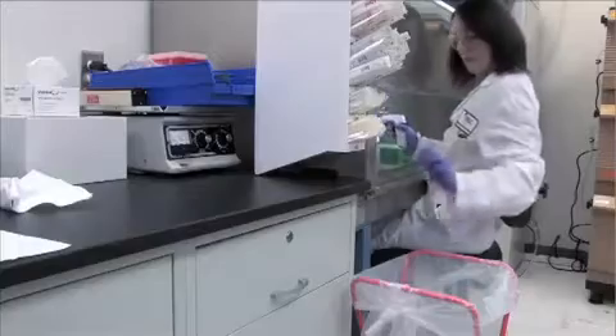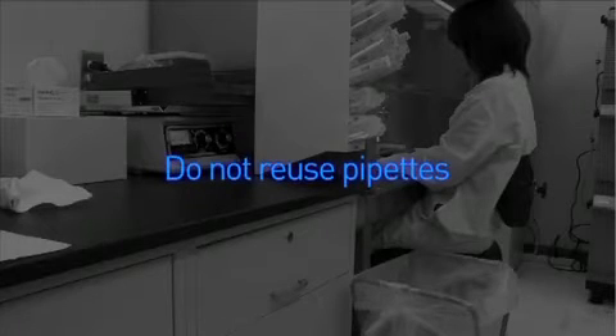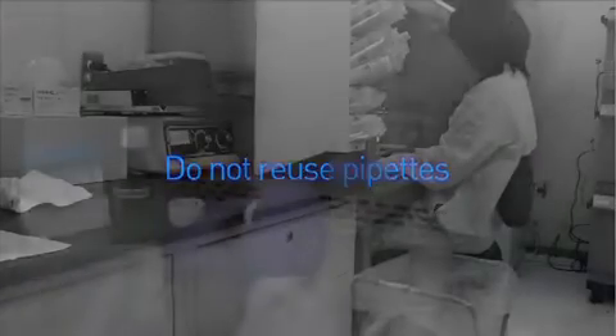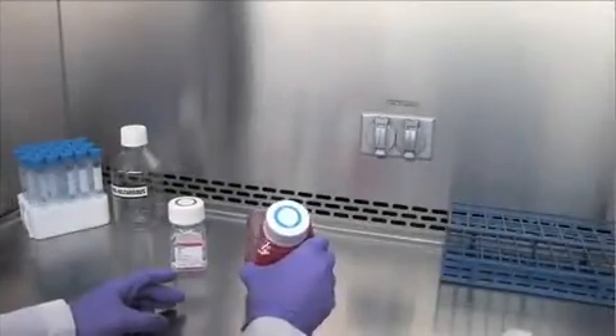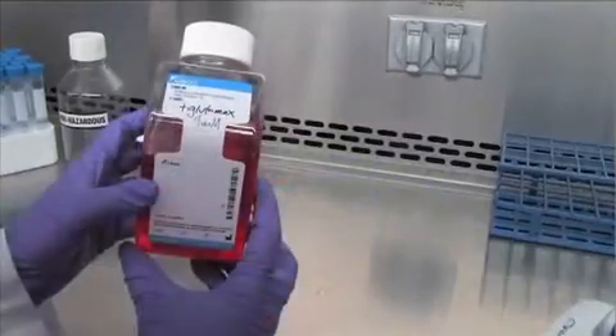Each pipette should be used one time and discarded, or washed if using glass pipettes. Reusing pipettes by dipping directly into another media bottle or by leaving it standing in a media bottle increases your chances of spreading contamination. Gently mix the contents after supplementation. Labeling the bottle after supplementation is good laboratory practice.